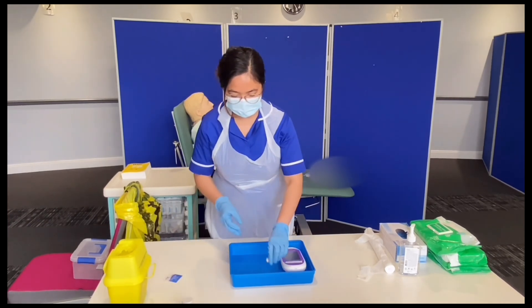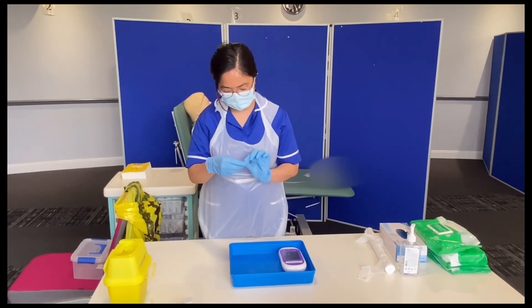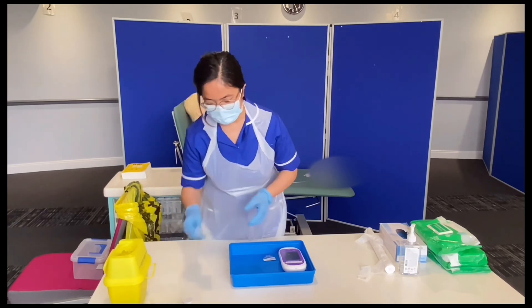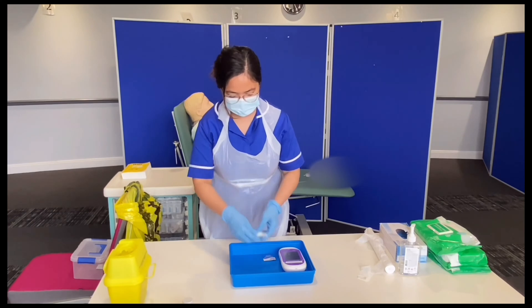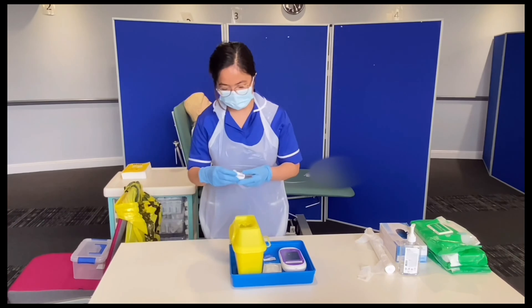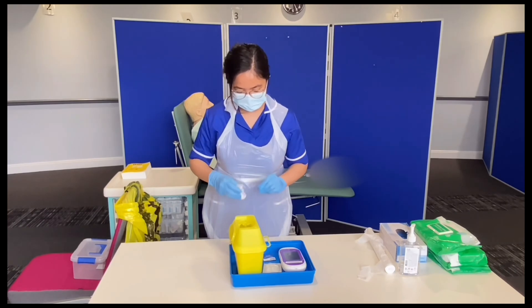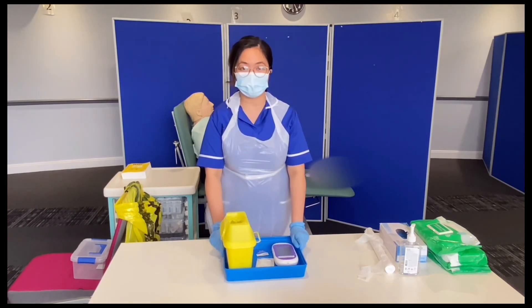I'm going to get my single-use lancet. I'm going to get my clinell wipe — in date and packaging is intact. I'm going to get my sterile gauze — packaging is intact and in date as well. I'm going to get my sharps box. And I'm going to get my glucometer strip — I can see it's an airtight container and it expires in 2022. I've got my equipment ready and now I can go back to my patient.